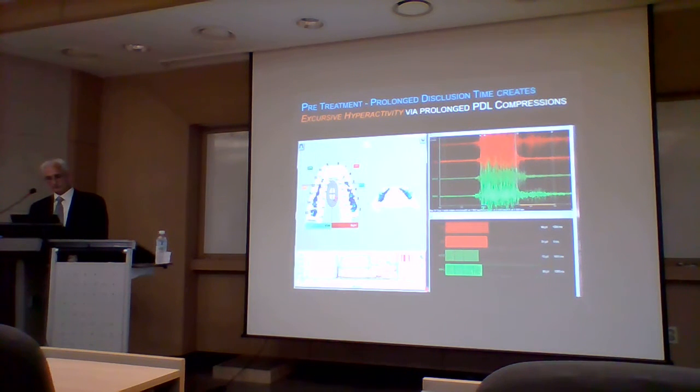전치부 가이드 없이 구치부에서만 그런 펑션으로 하고 있고요. So in the EMG, she bites down, holds her teeth together, slides to the right through here. And you can see when she slides to the right, she has high temporalis firing, high masseter firing. ABCD가 찍어주는 건데 C가 이제 시작되는 부위겠죠. 그 부위를 봤을 때도 템포럴 머슬과 마세터 머슬의 액티비티가 높게 기록되고 있어요.